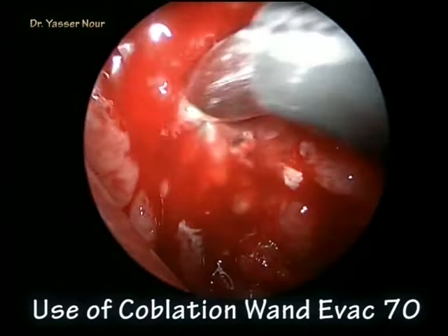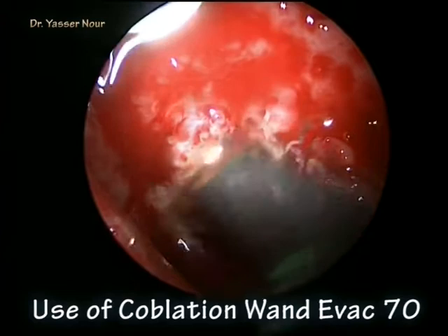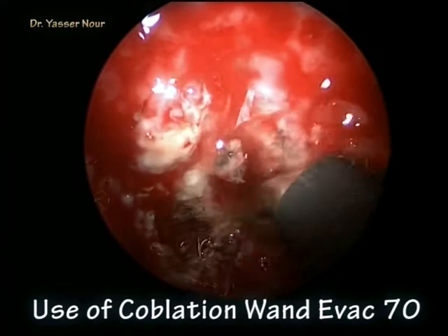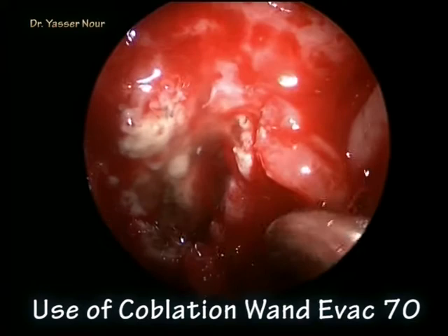The EVAC-70 is the handle used for this procedure. It has to be bent in order to reach the nasopharynx. Using the EVAC-70, the remnant of the adenoid is ablated and at the same time a state of coagulation is induced. This has to be done step by step in order to remove the entire remnant of the adenoid.